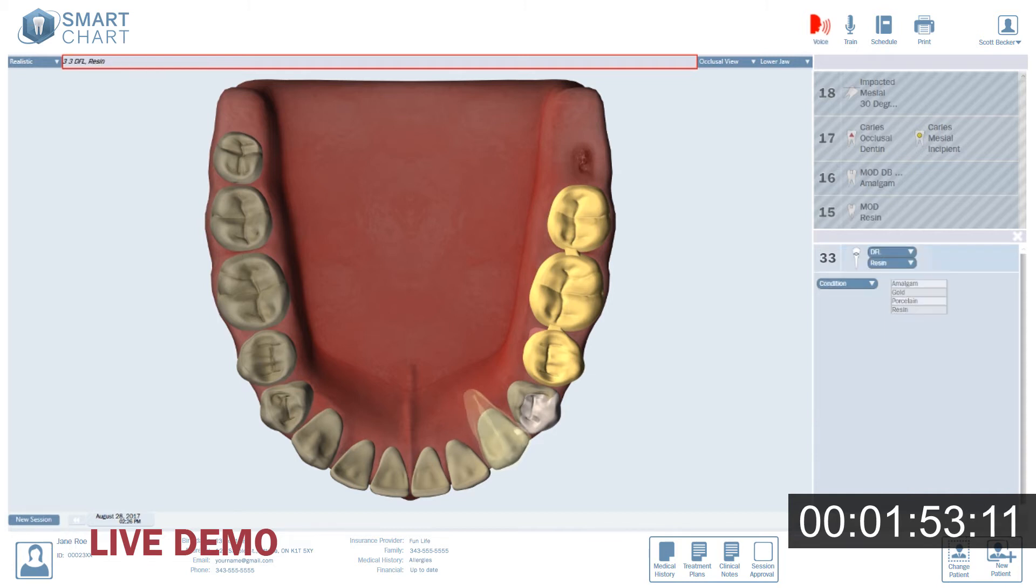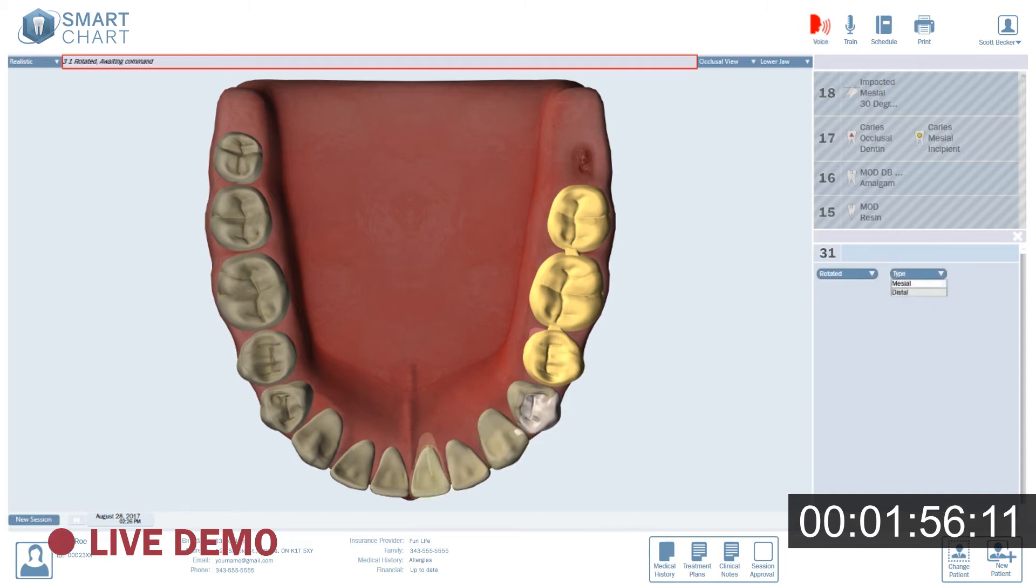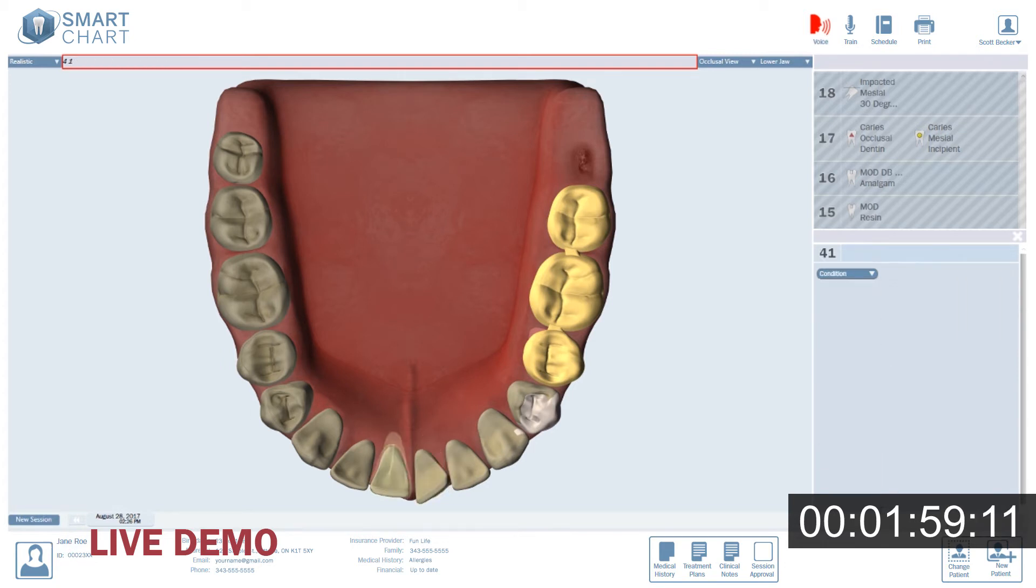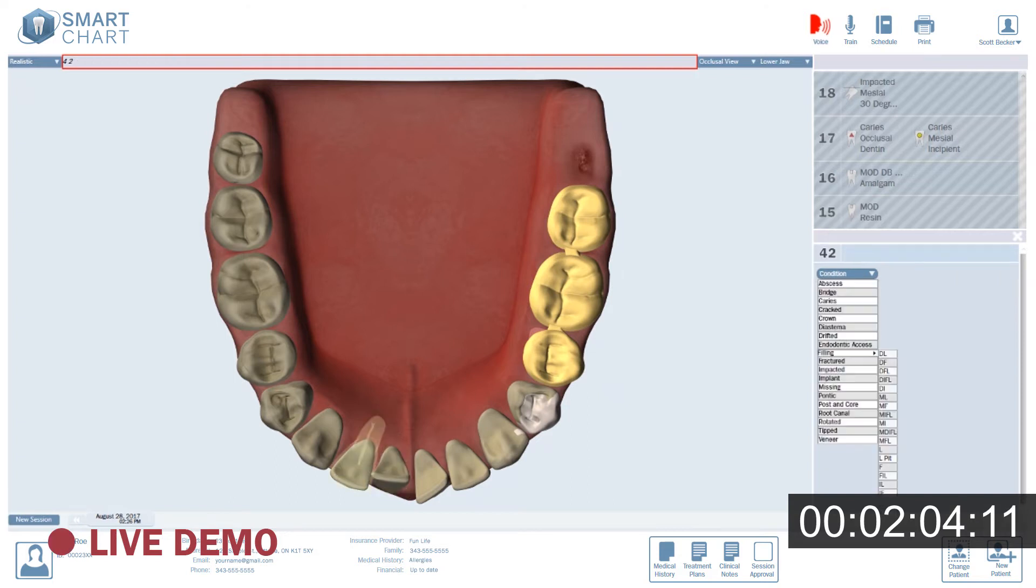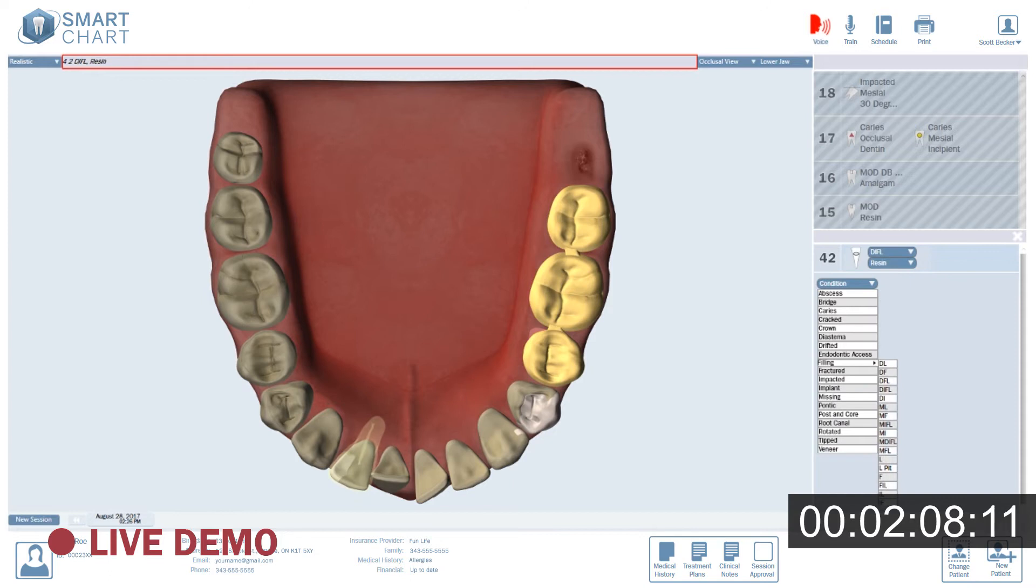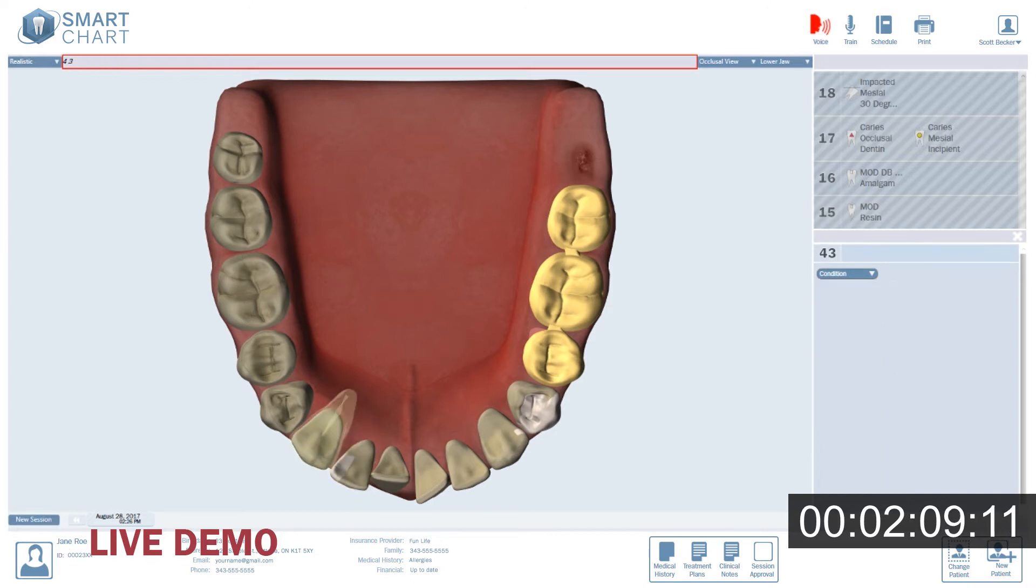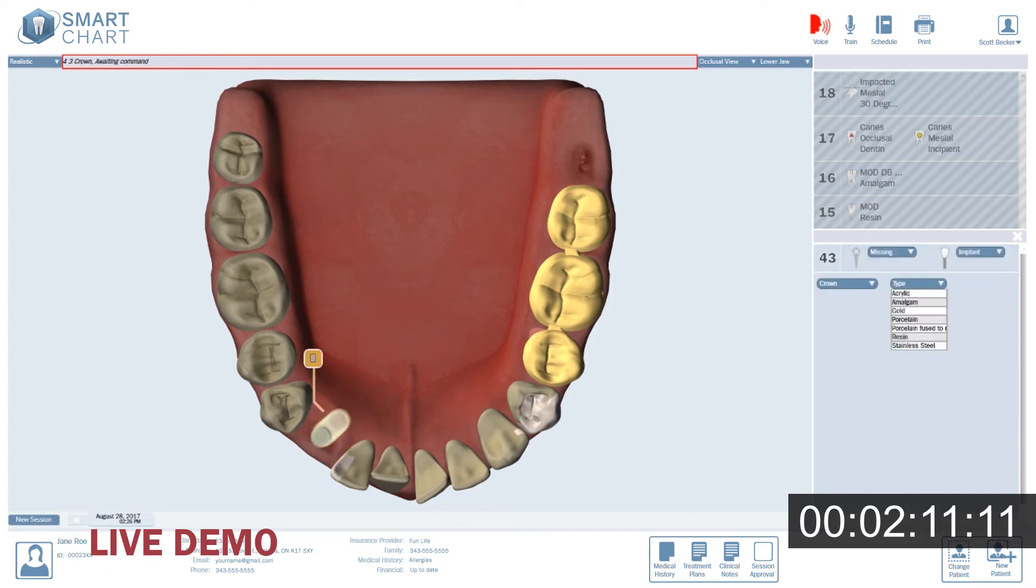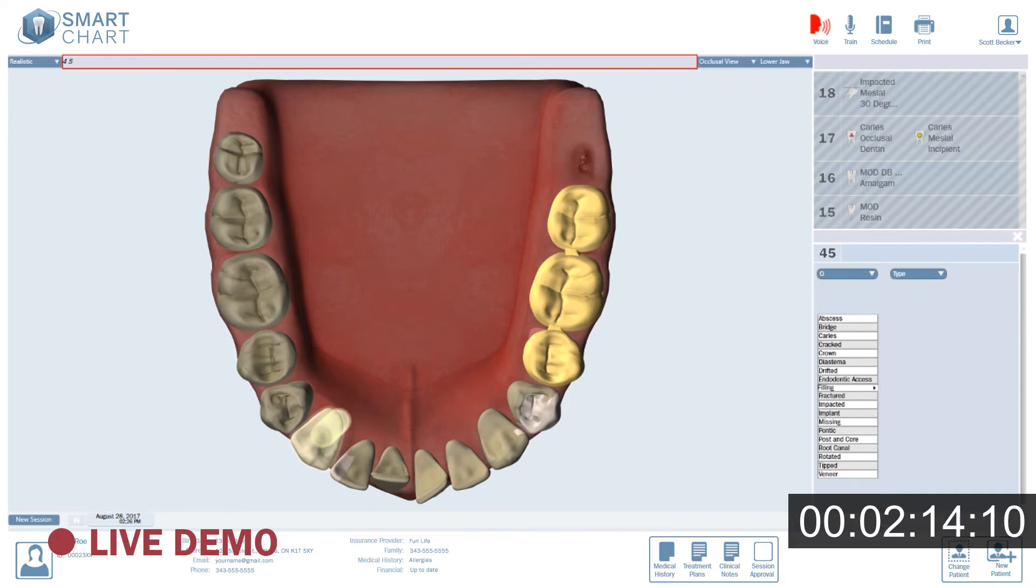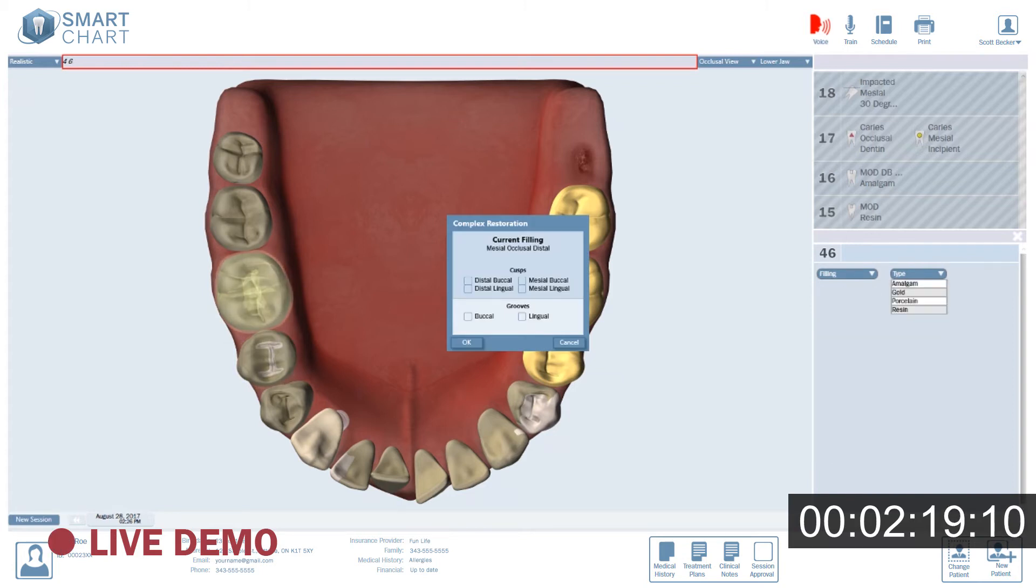3.1. Rotated. Distal. 30 degrees. 4.1. Tipped. Lingual. 15 degrees. 4.2. D.I.F.L. Resin. 4.3. Implant crown. Porcelain. 4.5. Occlusal. Resin. 4.6. M.O.D. Mesial lingual cusp. Distal buccal cusp. Amalgam.